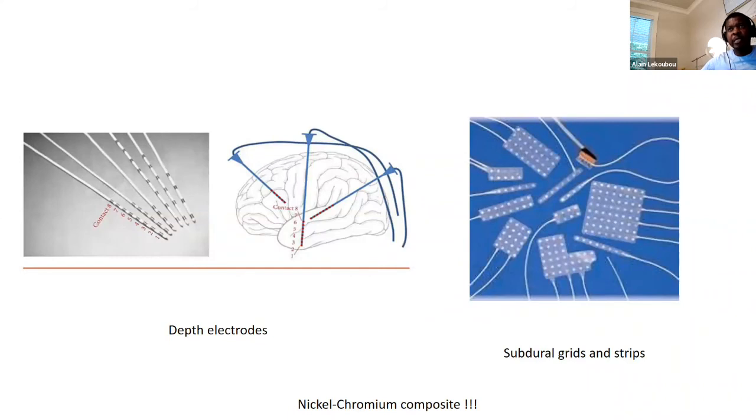You do an EEG and you see what we call spikes, those little blebs on the EEG, on the left or on the right side. Are you going to just go ahead and take the right side of the temporal lobe? You can't do that, because the seizure can still come from the left side.